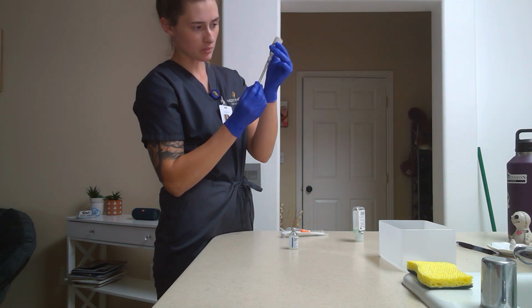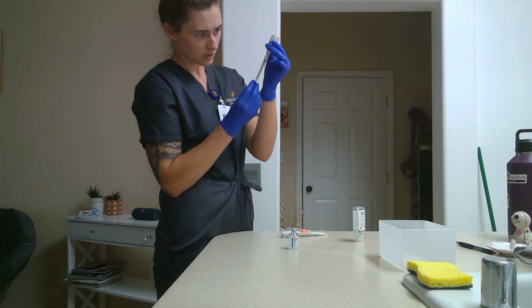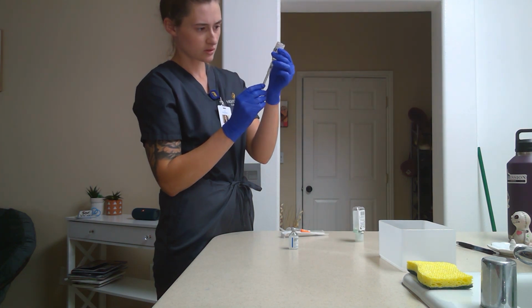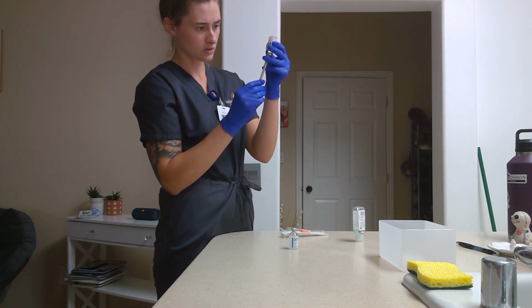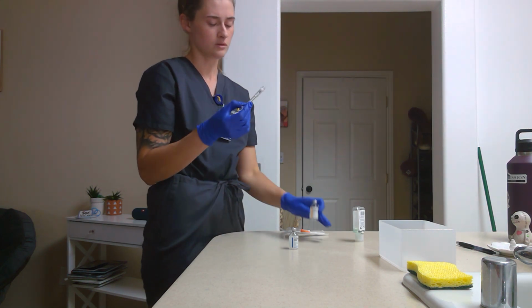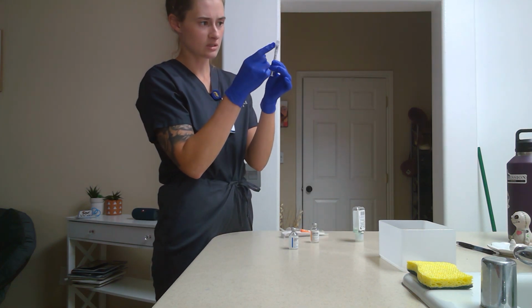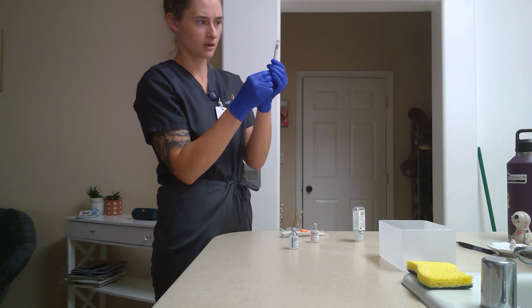If I happen to get any bubbles, I'm going to have to remove those before I go into my NPH. You can do this by just hitting the side here, or even pulling back and pushing back up.